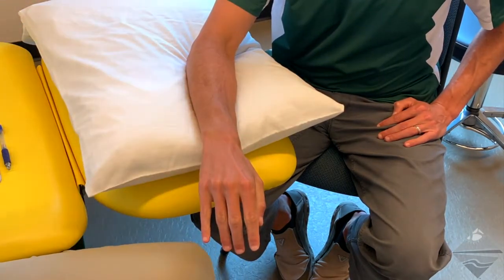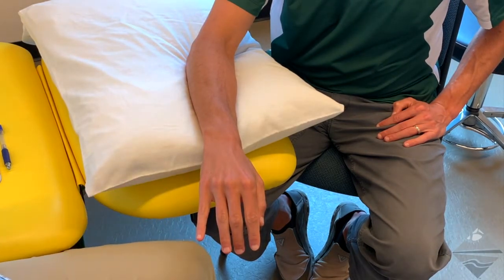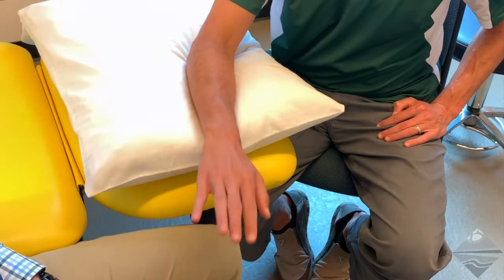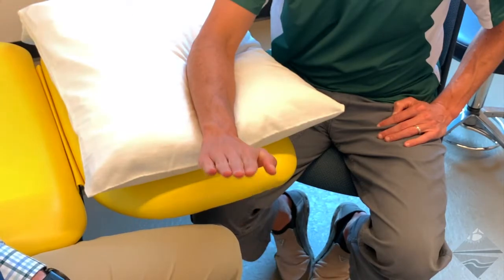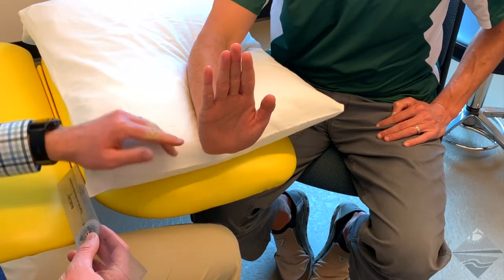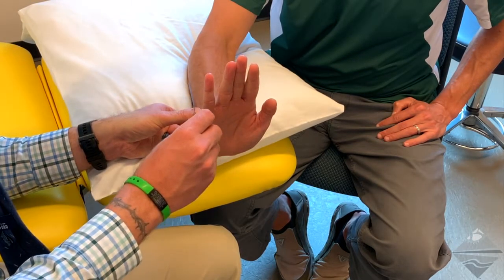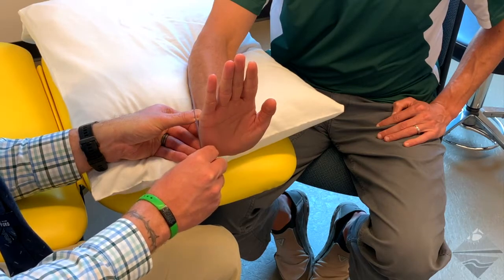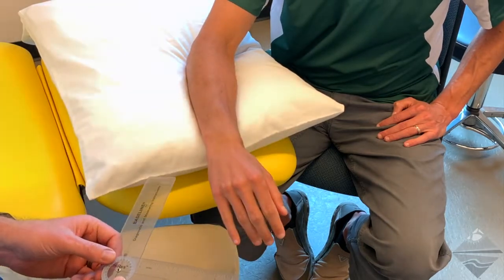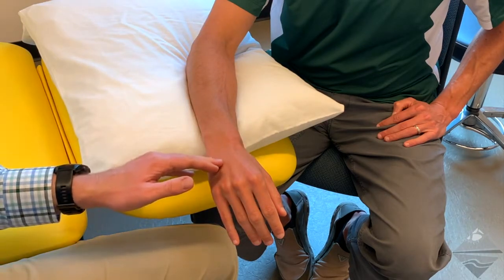Now that you have an idea of the amount of active range of motion that is present, we can take a formal assessment. For wrist extension, we're going to begin in a palm down position and ask the individual to extend their wrist. We're going to align our goniometer with the ulna — the ulnar styloid process is going to be our axis of rotation — and then line up our mobile arm with the fifth metacarpal. We take our measurement, and this individual has 86 degrees of active wrist extension.